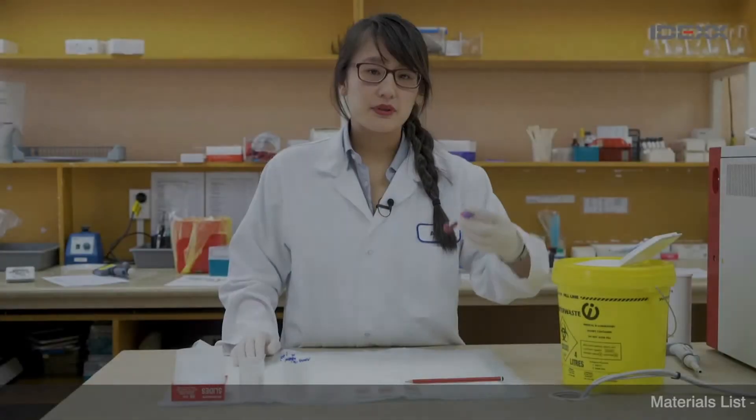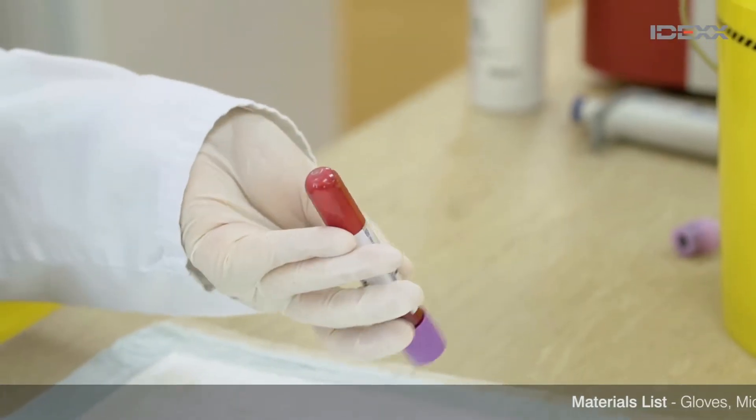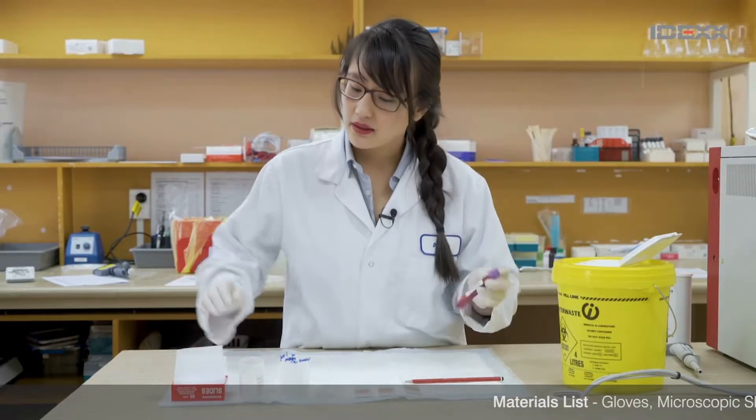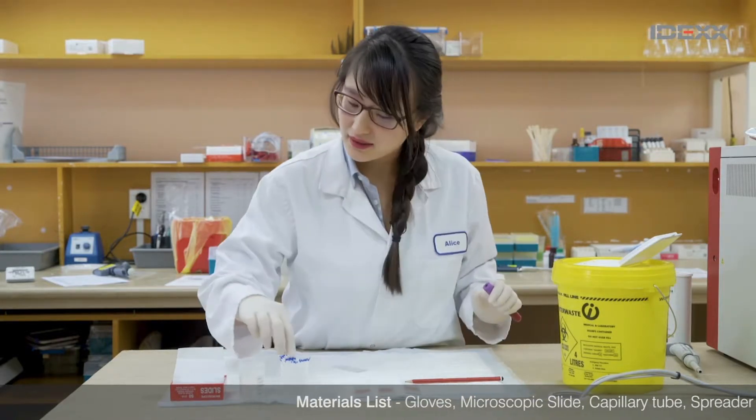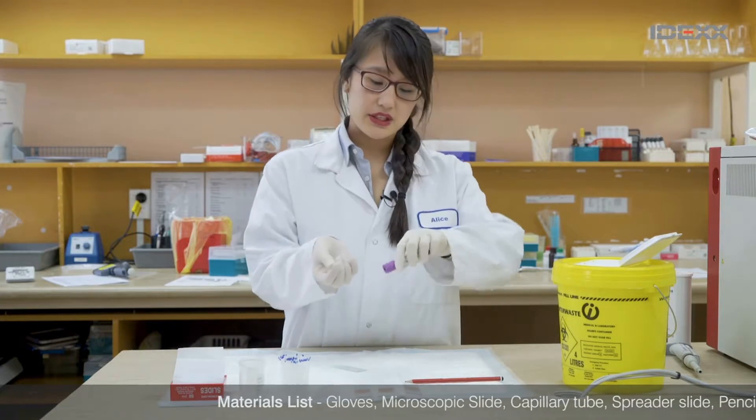To start with, I've got all my supplies here that I need. First of all, just take your blood, give it a few inverts, take your slide, make sure it's the right way up — cross it side up — then take a capillary tube.